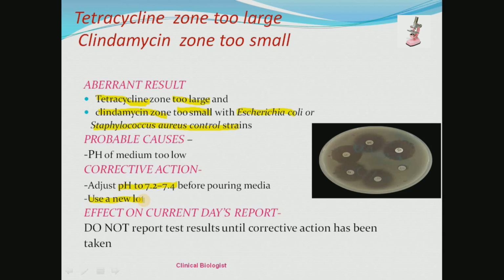Once you correct the troubleshoot, what do you have to do? Before correcting, should you produce the report? Don't report test results until you correct this action. Correct the action first, then produce your report of the test result. That is very important.